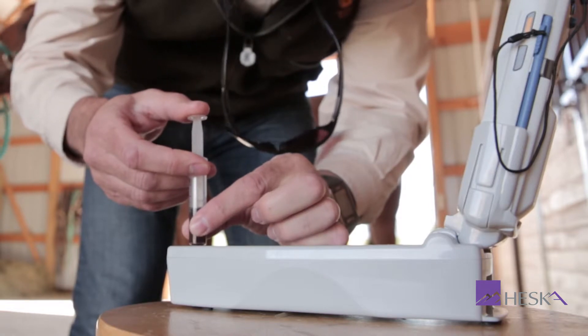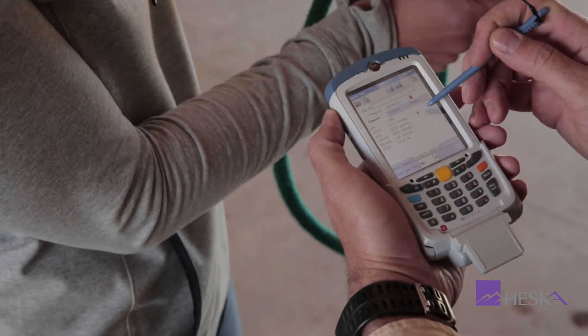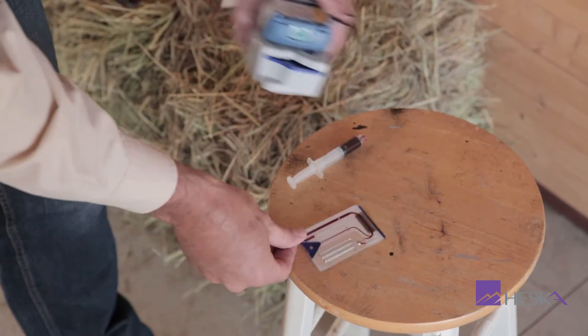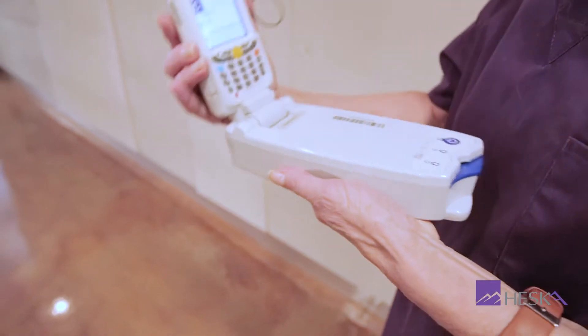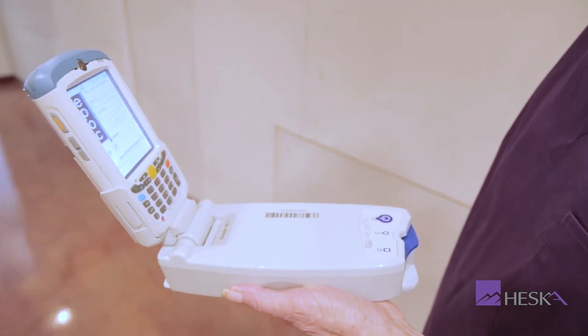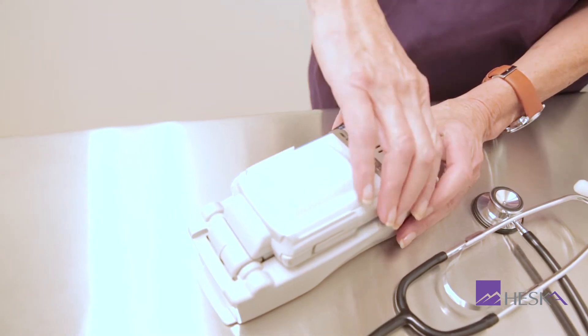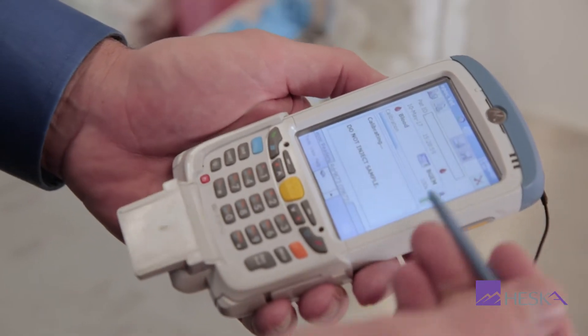With programmed reference ranges for dog, cat, and horse, this analyzer is perfect for in-clinic and field use. In emergency and critical care situations, the EPOC provides a robust tool for serial testing, fine tuning of fluid therapy, monitoring of post-operative conditions, management of diabetic symptoms, and more.